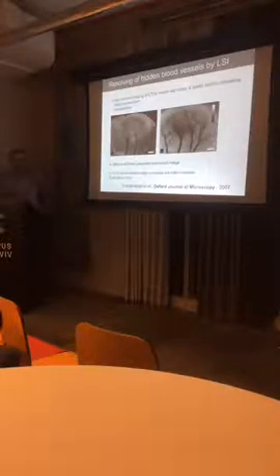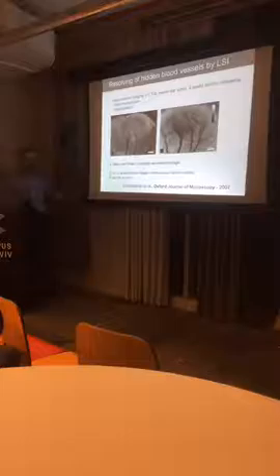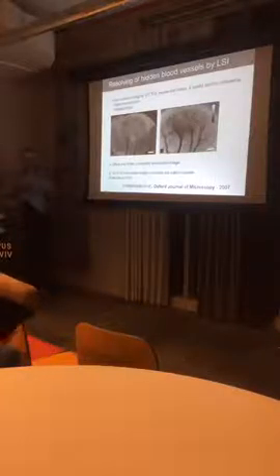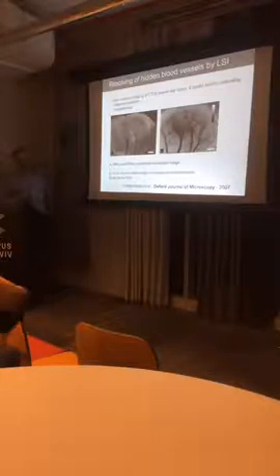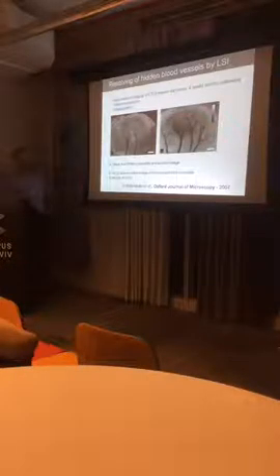So the most interesting benefit is not just that it's very simple, cheap and affordable, but it can also take a panoramic image of everything in the area, for example, 2 by 1 or 2 by 3 centimeters. This is laser speckle imaging, so we see blood flow inside the tumor, at about 1 or 2 millimeters depth.